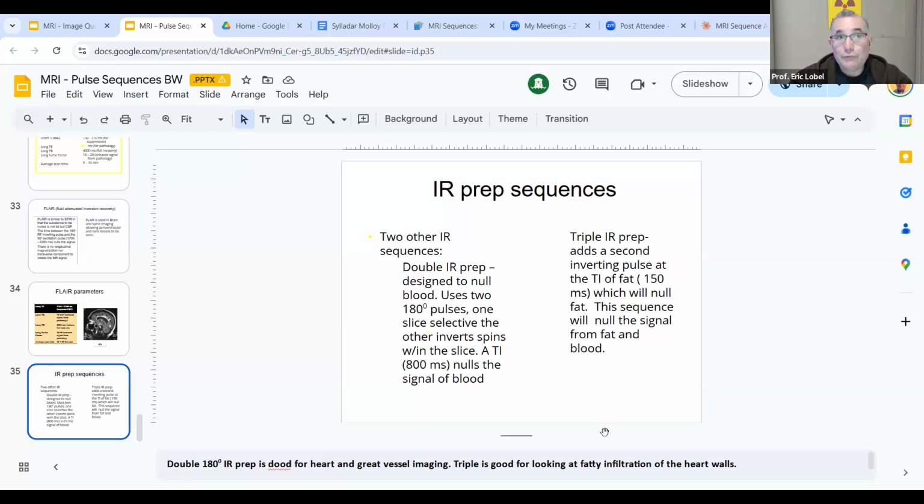Here's a very important one: the spin echoes are good for weighting T1 and or weighting T2. The other ones lean towards a particular weighting. They're not as, I can do everything with them. Which reminds me, I also have an Excel spreadsheet that I will send you.